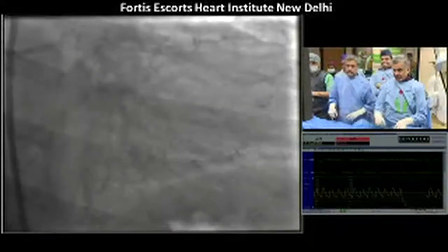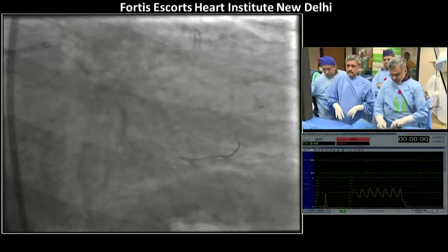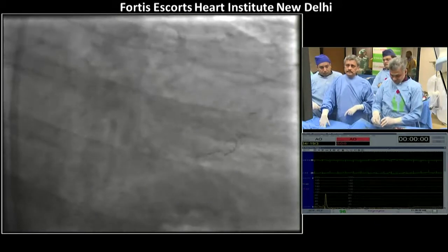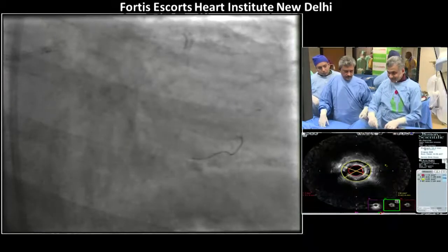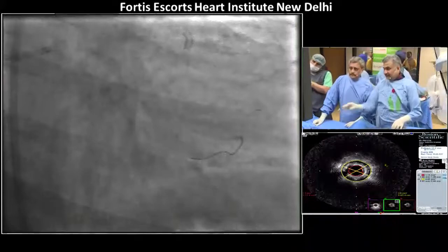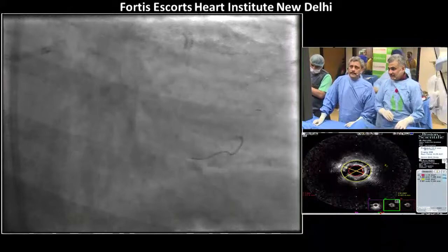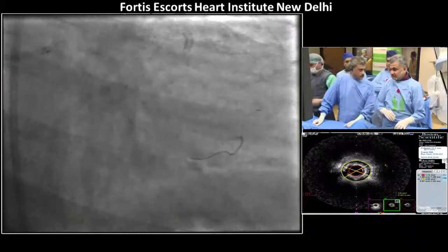So at this point of time, what do you say? Should we go with the stent now? What do you think, Ramesh? I mean, these vessels are so diffusely diseased. No matter what we do, the outcomes are not so great, in my opinion. But yet, we are here in a situation where we have to treat the dissection, which is STEMI, and I would put a 2.25 stent. I don't know whether it is 2.5. The worst thing to happen is actually to get a perforation with this lady, and I would put a 2.25 stent and post-dilate and get out.